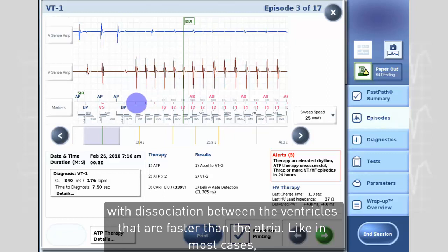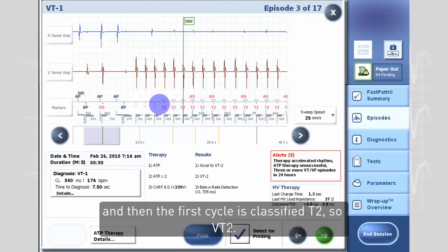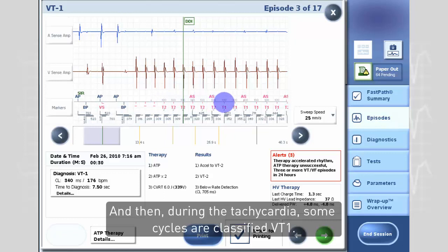Like in most cases, the first cycles are unbinned because there is a discordance between the current interval and the average value. Then the first cycle is classified T2, so VT2, and then during the tachycardia some cycles are classified VT1.